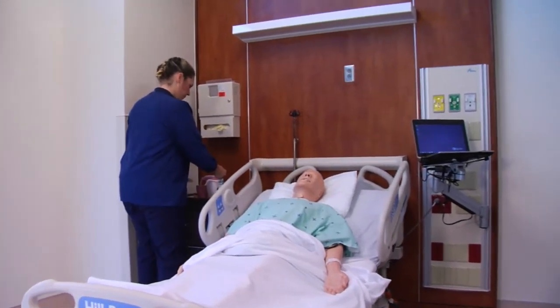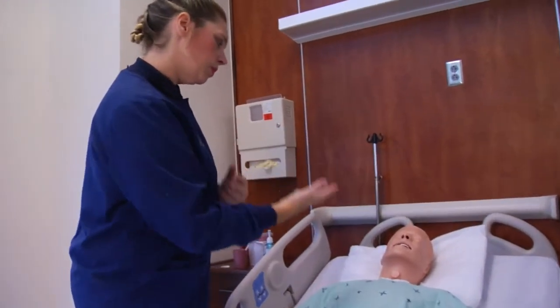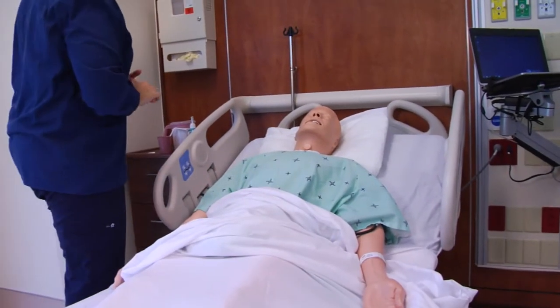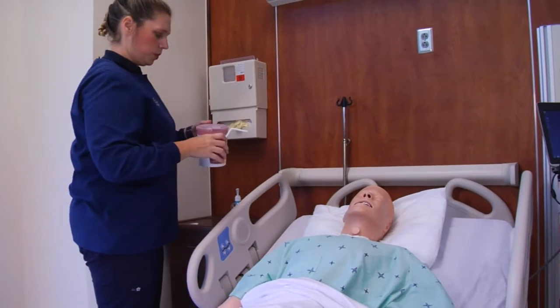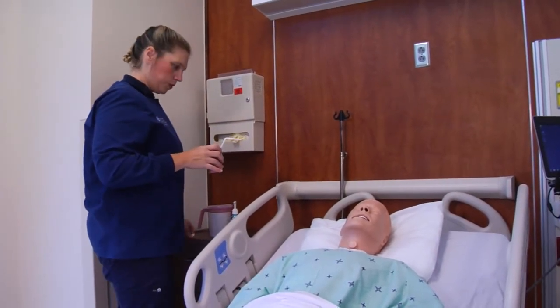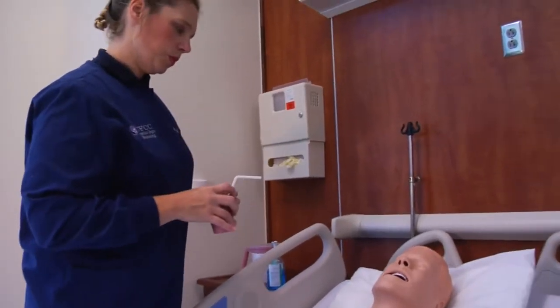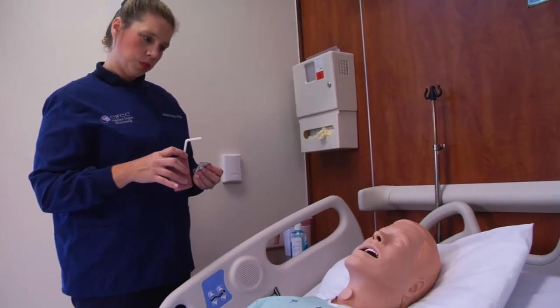performs hand hygiene, acknowledges the client, introduces herself, and explains the procedure to the client, including the approximate length of time needed to perform the dressing change. The nurse will assess the client's need for pain control and administer medication as ordered, allowing time for the medication to take effect before beginning the dressing change.